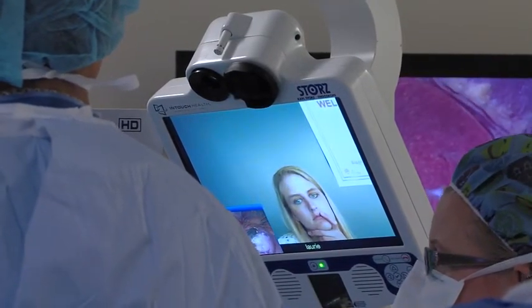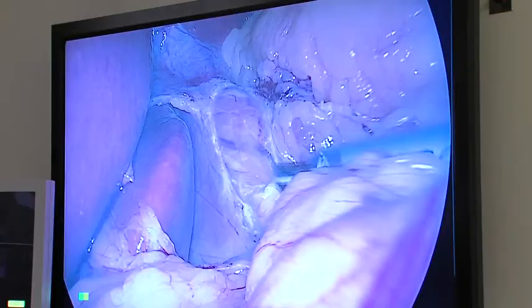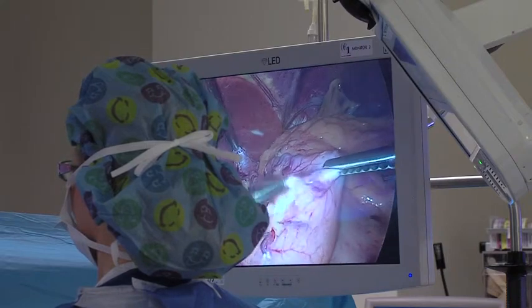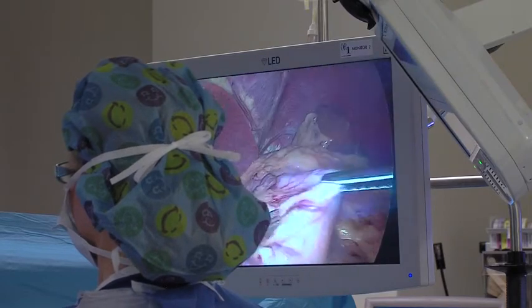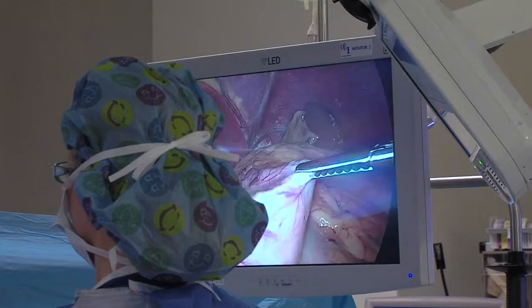So they can see what's inside the patient, they can see what's outside, and with a joystick they can move it around and actually see what's going on. So it really is like being there without being there. The physicians learning the procedure, who might be in South America or even Cincinnati, Ohio, can watch Dr. Higa in real time and control the views, just like they were standing there with him.